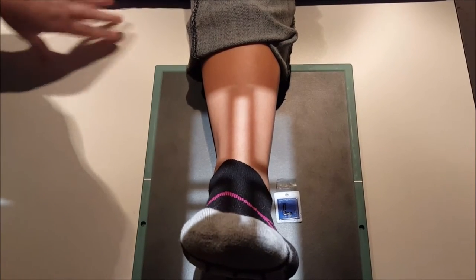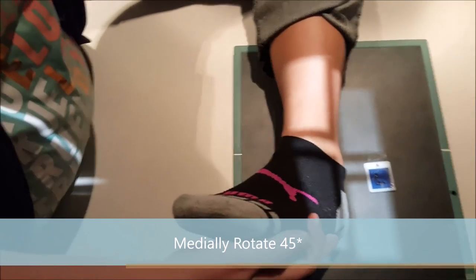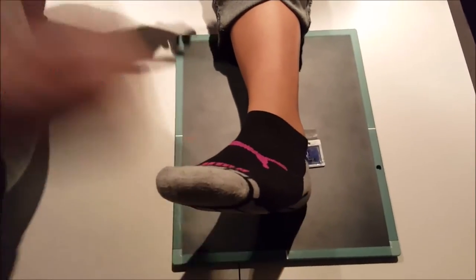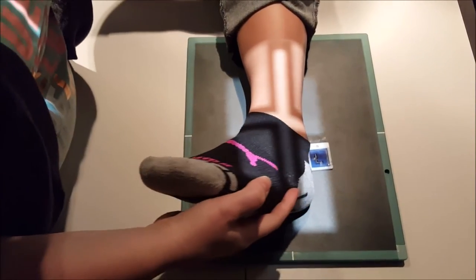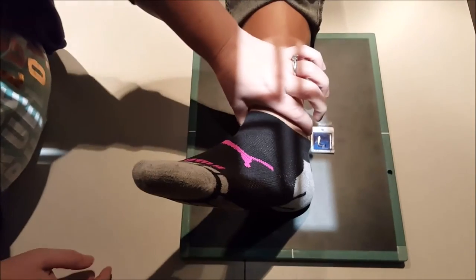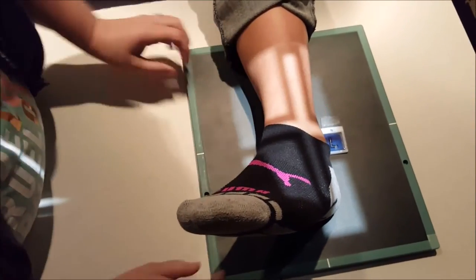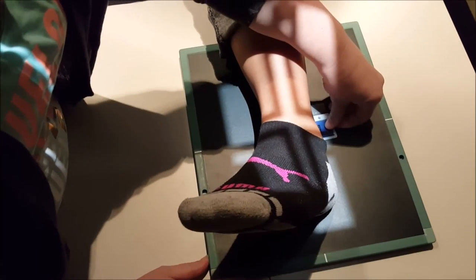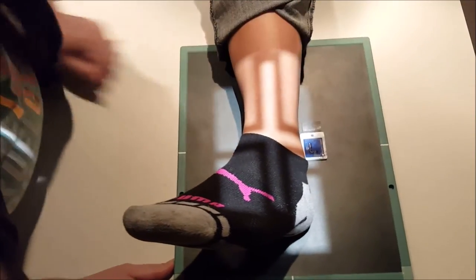For the medial oblique, you're going to go a full 45-degree angle of the ankle. You're still going to be centered midway between the malleoli. We'll still have room for our marker on the lateral edge.